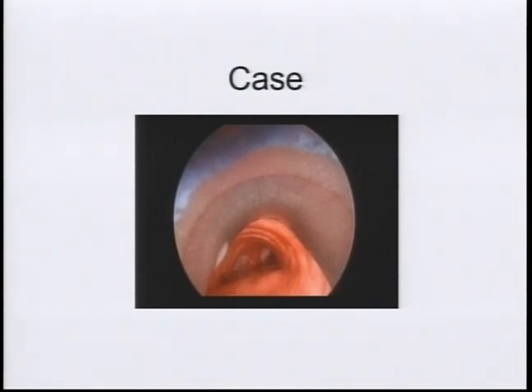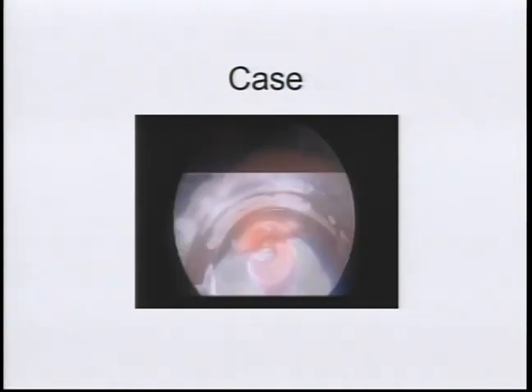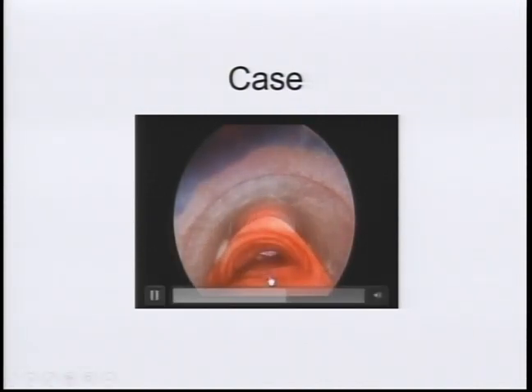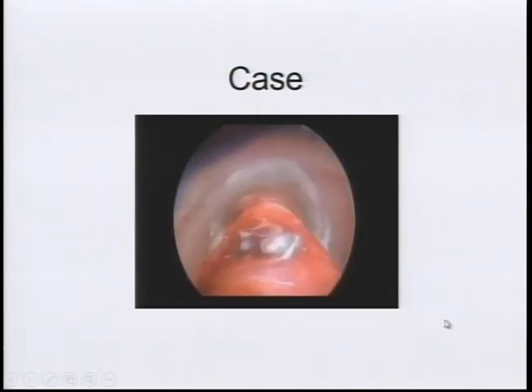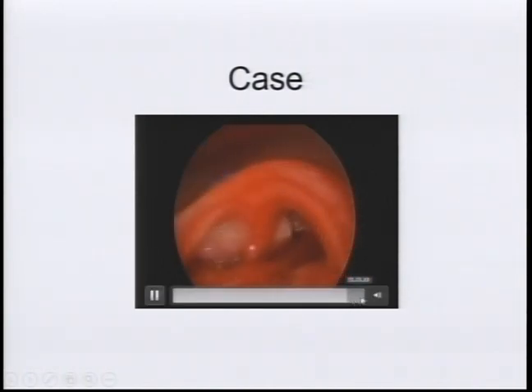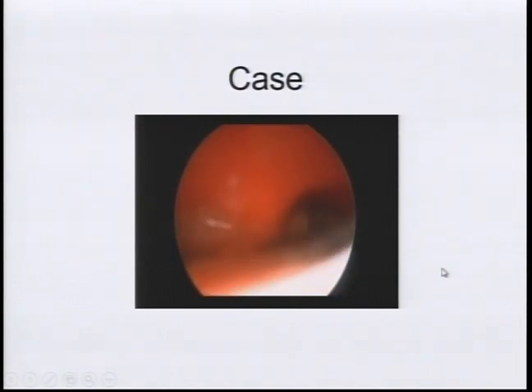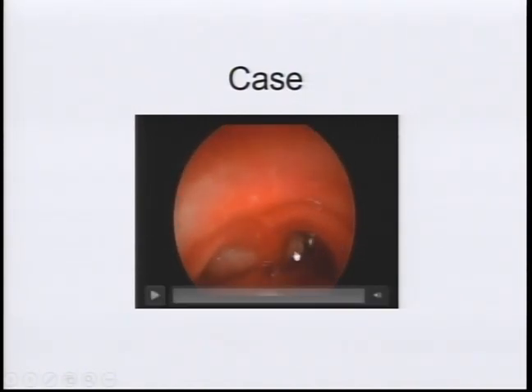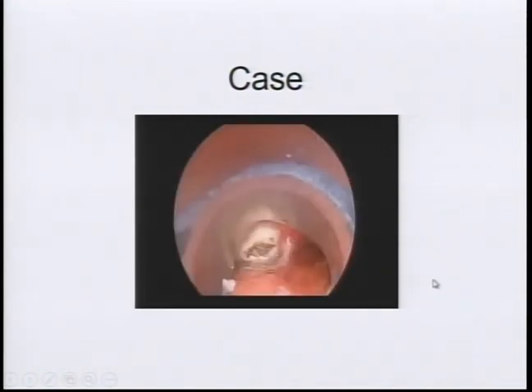And so this type of bronchoscopy, which uses a rigid barrel, allows you to control bleeding, allows you to use bigger tools to remove tumors. And I'll show you what we did in this case. So essentially the barrel goes in, and you can go into the left and right, but you can already see down there that there's tumor on both main stem bronchi. So just getting some light again there. And you can see how it was almost completely occlusive on the left, and she had some lesion on the right as well.